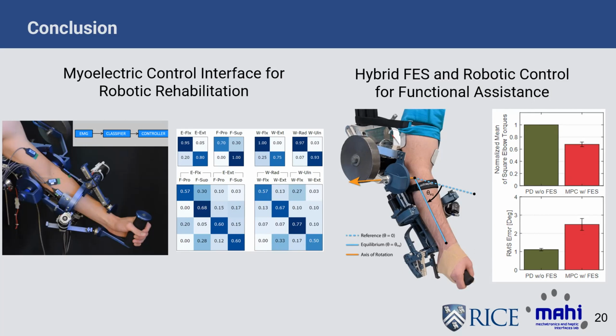Yeah, that's a great question. Inherently, both of these, especially our surface mounted systems, are highly affected by the exact way that you mount them, maybe if you've cleaned the surface before, the amount of resistance in the skin. So often these require a lengthy calibration procedure to actually get repeatable results and to get good results.